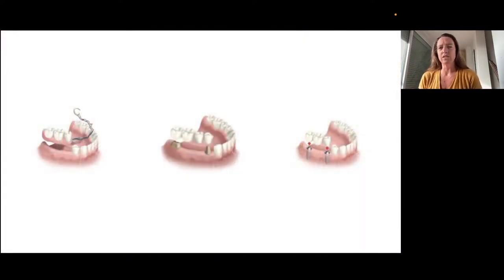So when we start to lose more than one tooth, and we have an area of teeth that is missing, what kind of solutions do we have? Of course, we know we have the traditional removable solutions that have existed for many, many years. And unfortunately, to substitute three, four teeth, we end up having to have something that is removable and will fit basically the whole mouth. The only advantage of a removable prosthesis is basically that in terms of costs, it is actually cheaper.